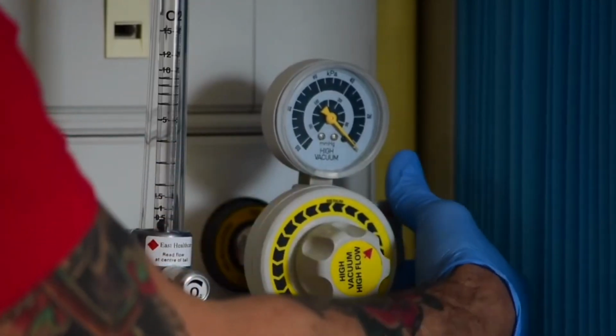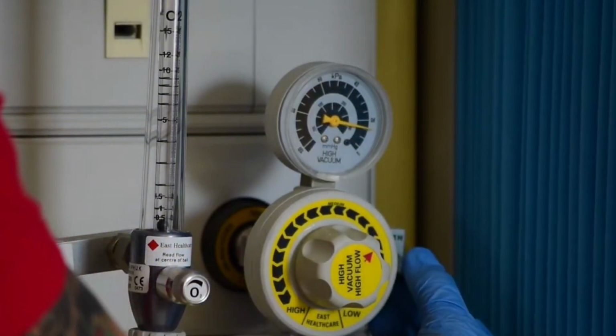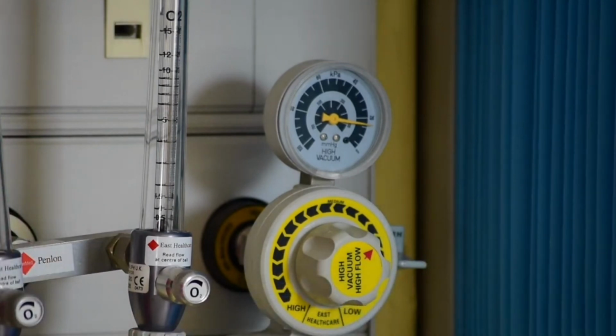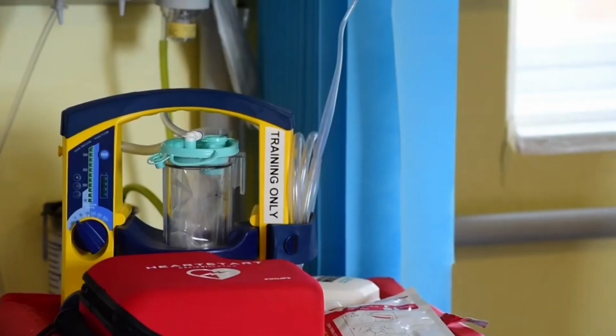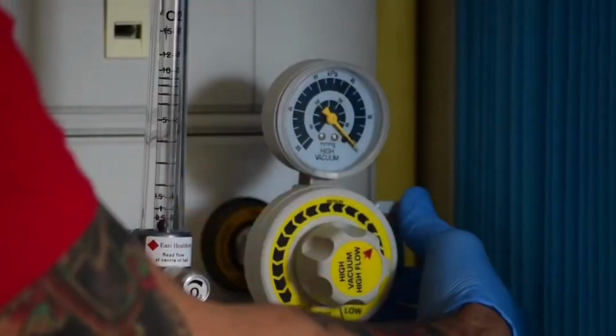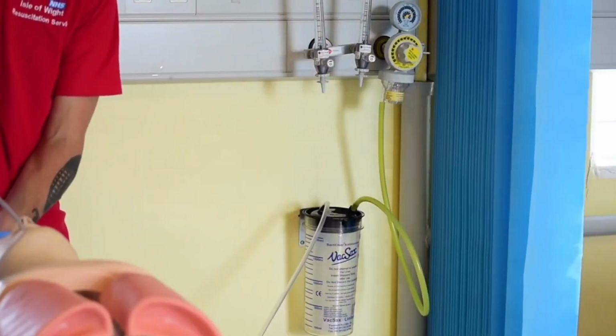Where the presence of liquid or semi-liquid obstruction is suspected, suctioning should be used to clear the airway. The suction equipment in the bed space should be checked and ready to use at all times, or a portable suction unit can be brought to a patient found in a location without access to this equipment. The suction regulator should be turned up to a level that will effectively suction the material from the airway.